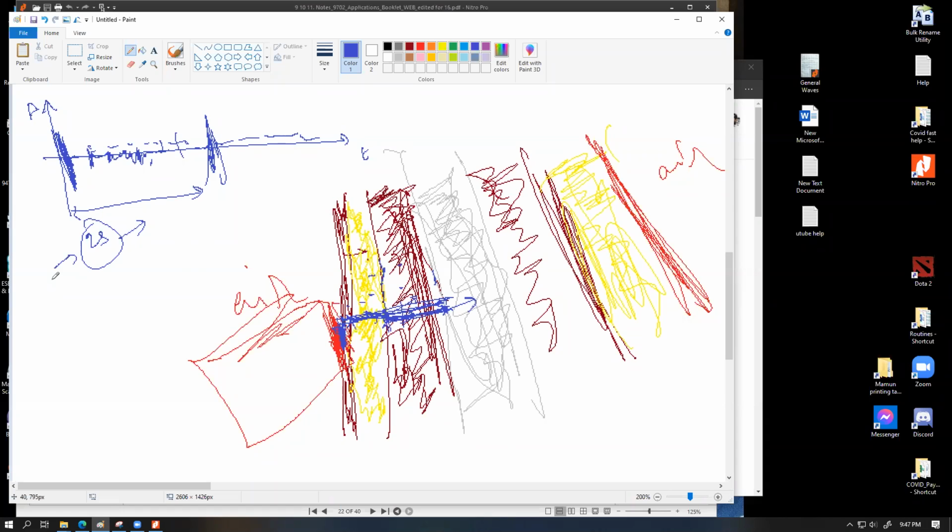Those locations are colored with a lighter pixel, for example a whitish pixel. Places where it takes less time, where we receive a stronger reflection, maybe the baby was not there in those locations, so we get a much higher reflected ray.